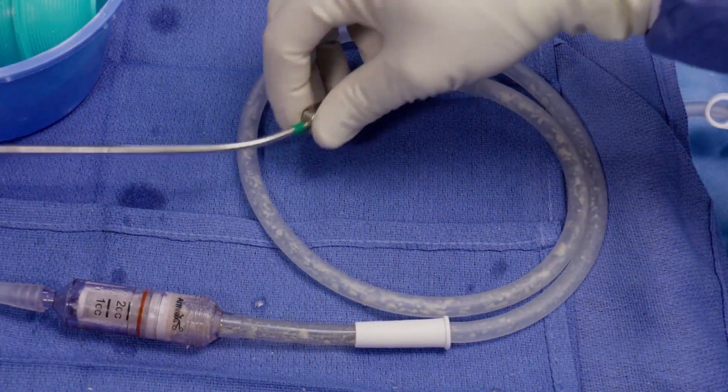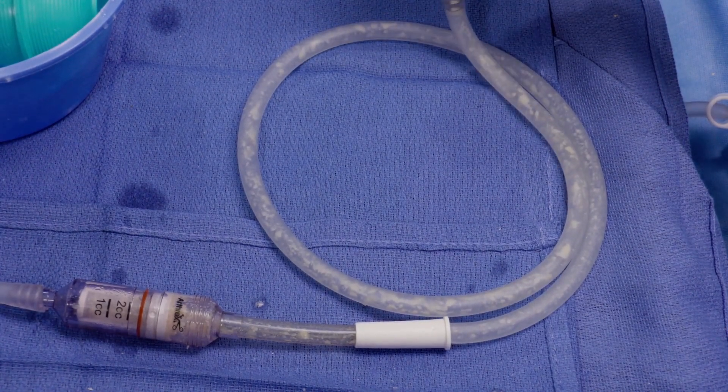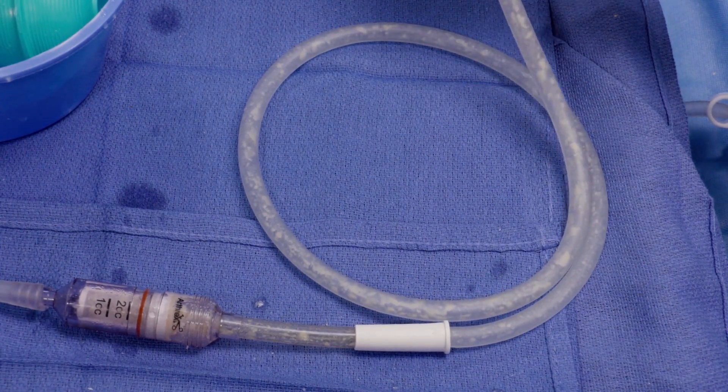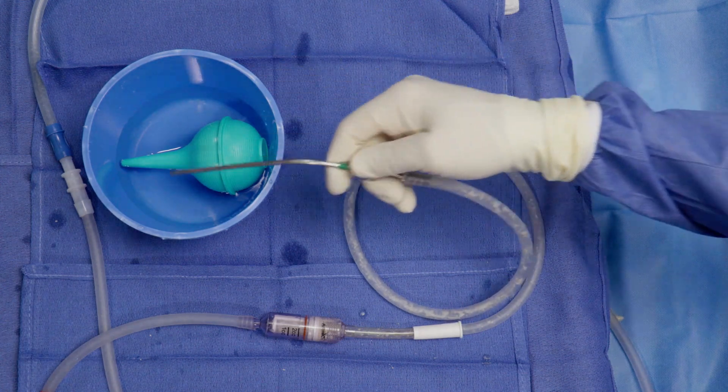After collecting your bone graft, the tubing — especially if you use the three-foot attachment — will have a fair bit of bone graft still along the suction tubing, so you'll want to make sure and collect that. This can simply be done by irrigating through the system.